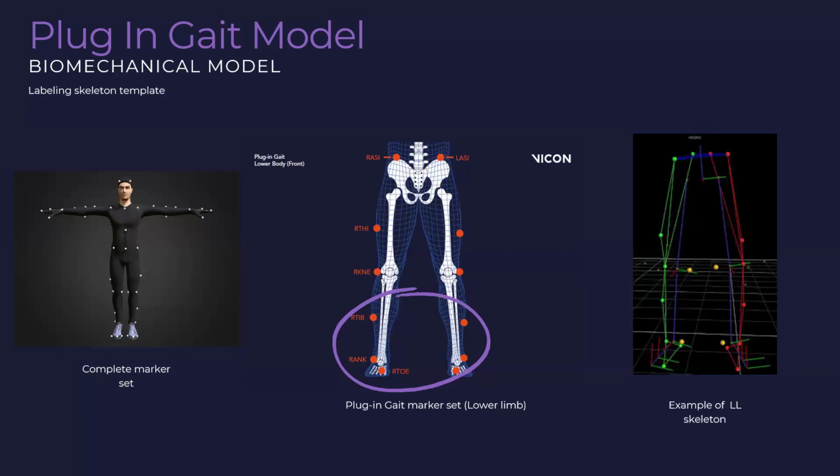So when you're getting data from your kinematics, from your Vicon, it says that, for example, you are on the trajectory and on the pattern, you are here based on the delay, based on the time passed, right? But in your Raspberry Pi, it measures your insole and the kinematics from the exoskeleton. Maybe you're here or here because there's a delay between the systems. There's a time difference between these two systems, right? Yeah. So how would you account for that?